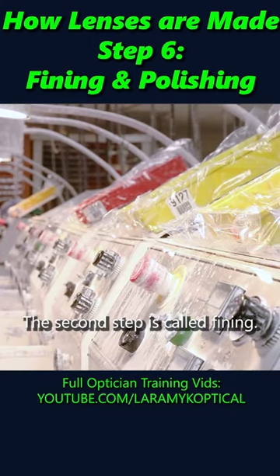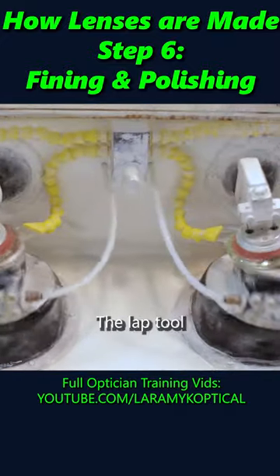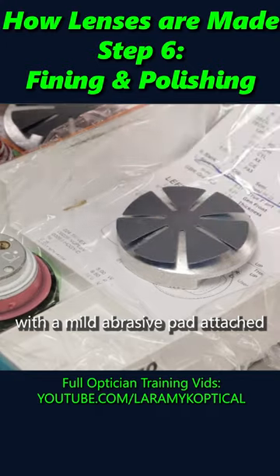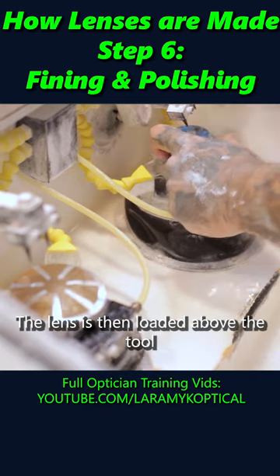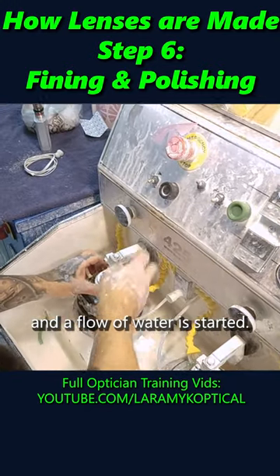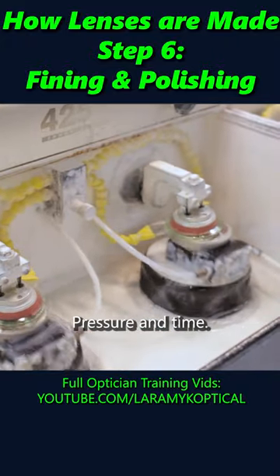The second step is called fining. Fining is done in these cylinder machines. The lap tool, with a mild abrasive pad attached, is loaded into the machine. The lens is then loaded above the tool and a flow of water is started. Then the lens is pressed against the pad for a set pressure and time.